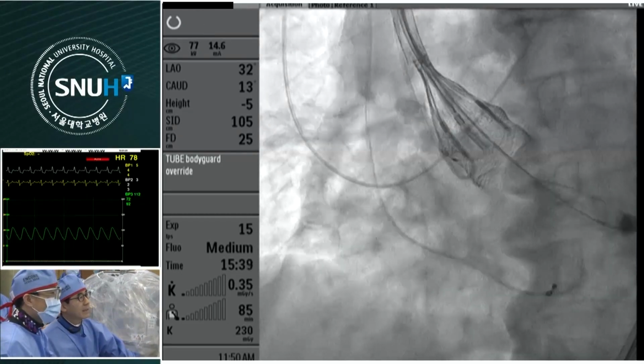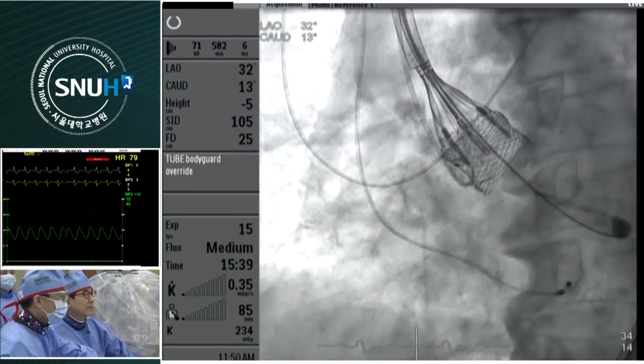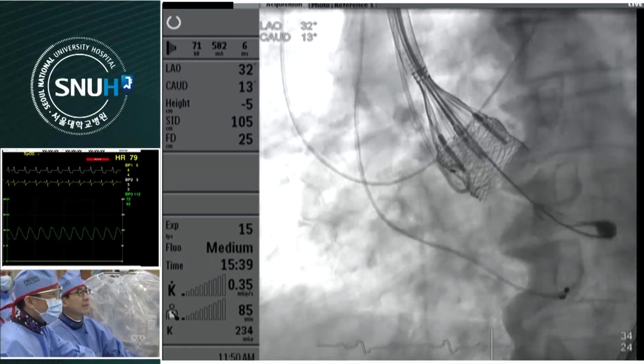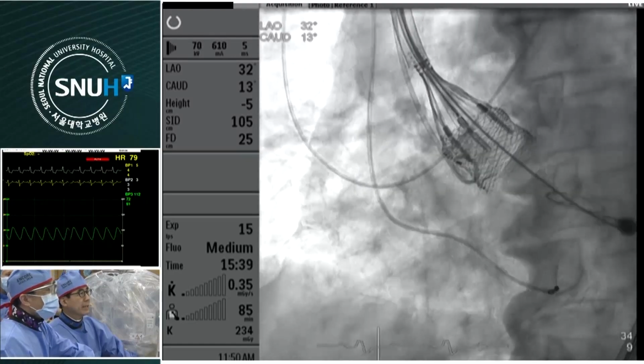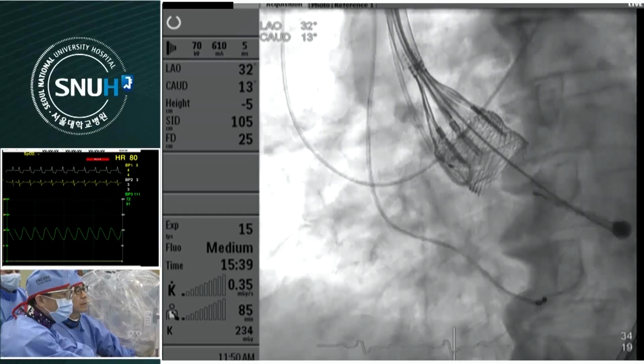Okay, good. Once again, Cine. No gap between buckle and post. Thus, I think the locking process is verified in all 3 sets. Okay, let's go.